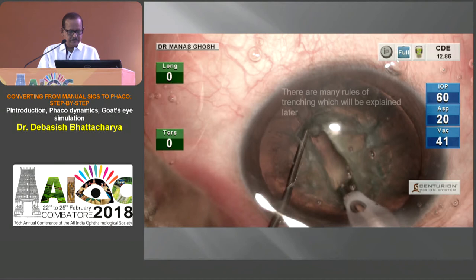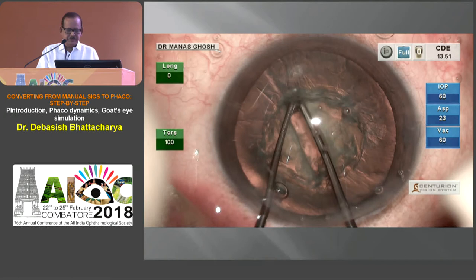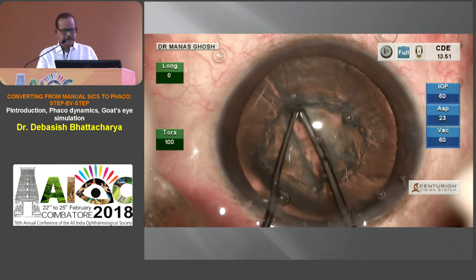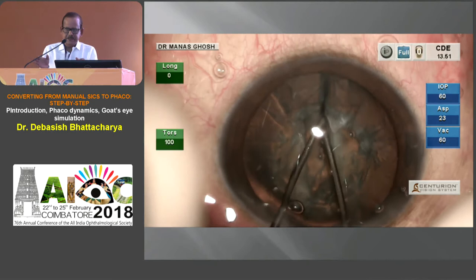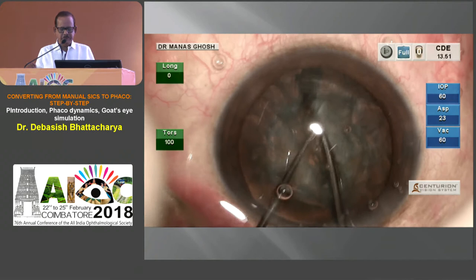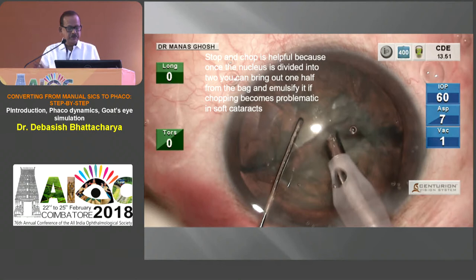There are many rules to trenching, and also to breaking the nucleus. Once you have trenched properly, see the red glow — you must start from the periphery and then proceed to the center, because the center plate will be slightly harder. It's like tearing paper: try to tear it from the center and it doesn't work that way. You can rotate it and go from the other end to have a complete crack. For stop-and-chop, go in, align — because you are using a 30-degree tip — align the phaco on the divided fragment, go to the middle, don't be superficial, give a small burst of energy, come back to position 2 — don't come back to 1 because then only irrigation is active and you lose the grip.